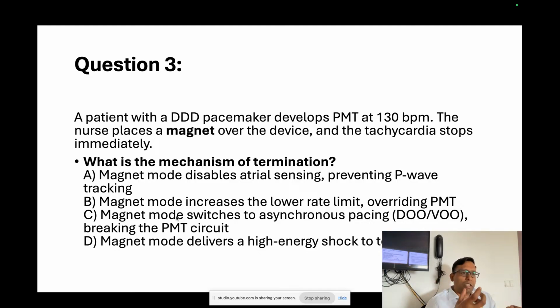And when you are putting the magnet on an ICD, what will happen? There is a difference between both the things. Therapy means VT-VF therapy we have kept in the patients. So VT-VF therapy, what is that? It will be ATP. It can go and give the shock. So if your patient is getting a lot of shocks and the patient is outside the hospital setting, you are not having the programmer. What next? You put a magnet, paste it, and bring the patient to the hospital.